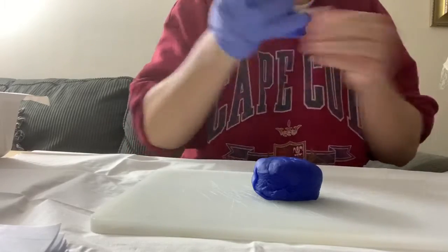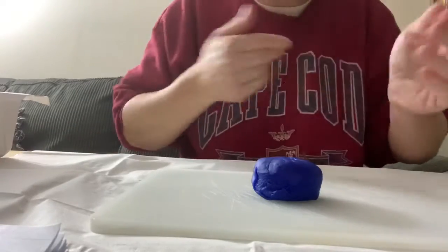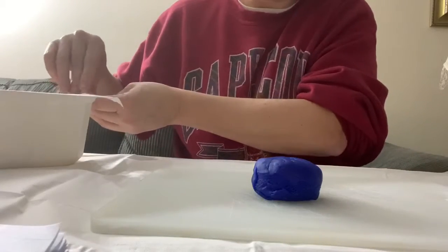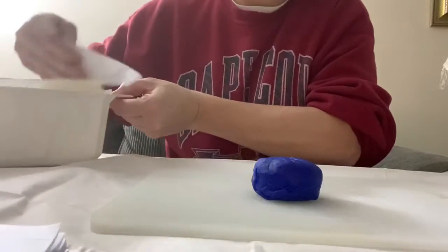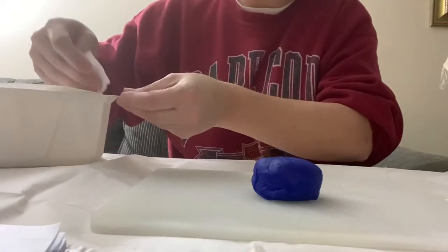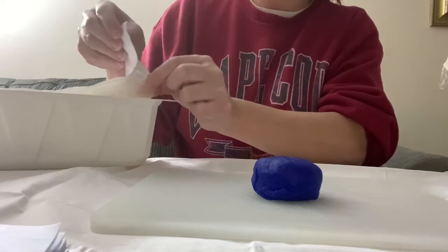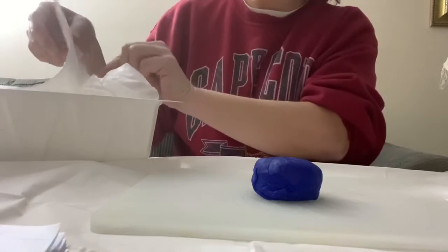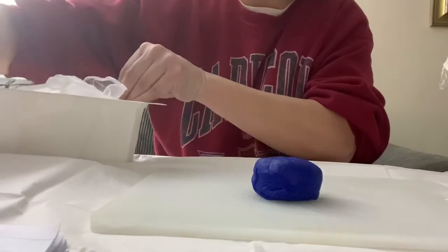And then I'm just going to pat that dry. I'm going to take off these gloves. I'm going to re-perform my hand hygiene. I've got my supplies right here, my catheter tray. The sterile gloves are sticking to the top, but I can actually grab it by this cuff here. As long as I hold them by these cuffs, it'll be okay.